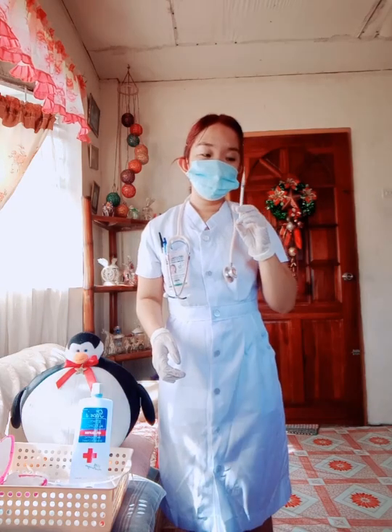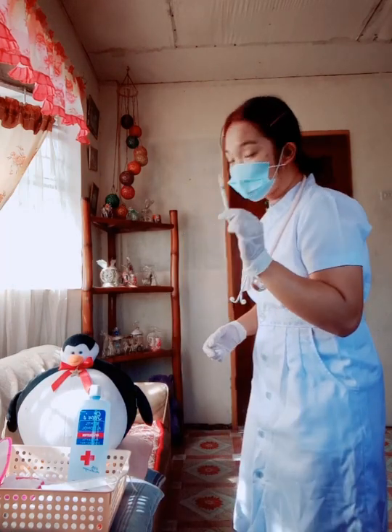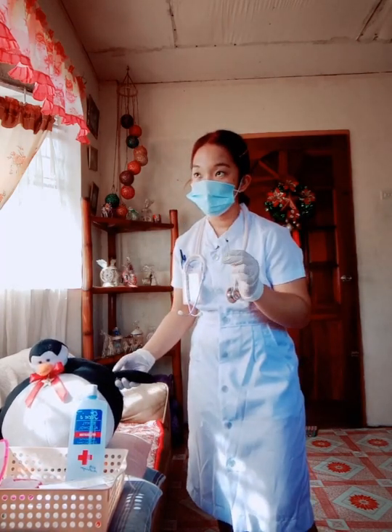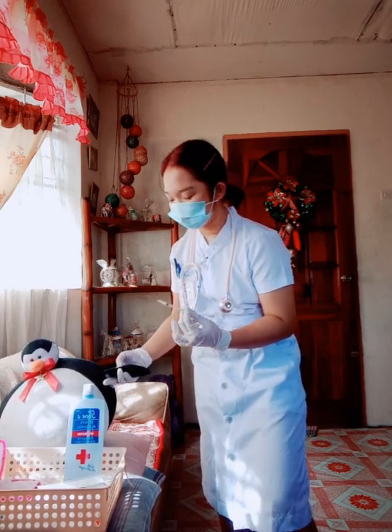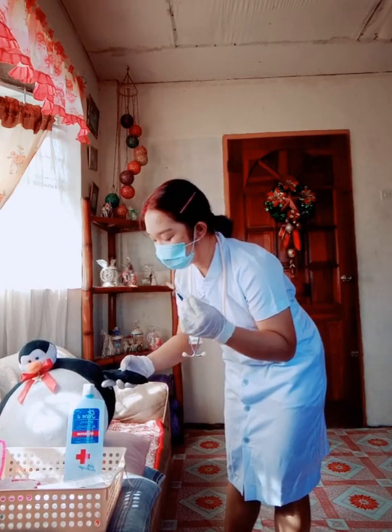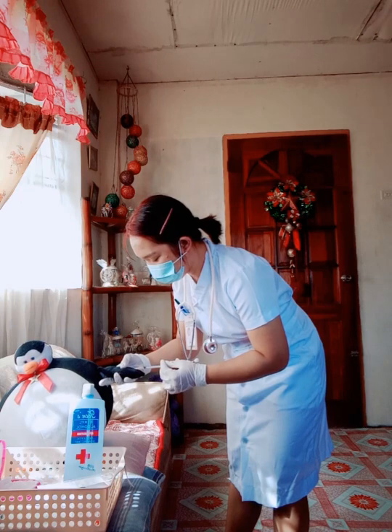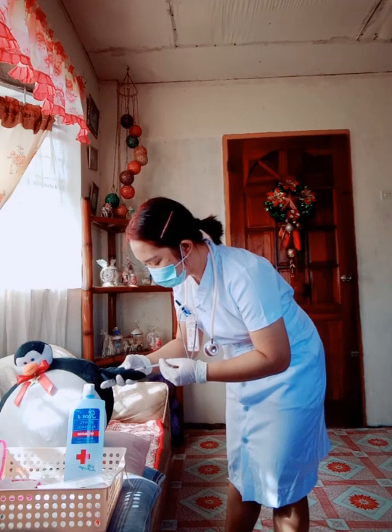Now, for the ninth step of the procedure, which is to inject the medication. Since this is an intradermal injection, we should always consider that the site of the injection must have less hair, or be comfortable for the patient. So, I am inserting this needle or syringe at a 15-degree angle since it is an intradermal injection. Imagine that I am injecting it into a real person.